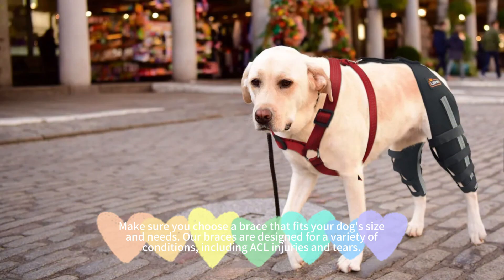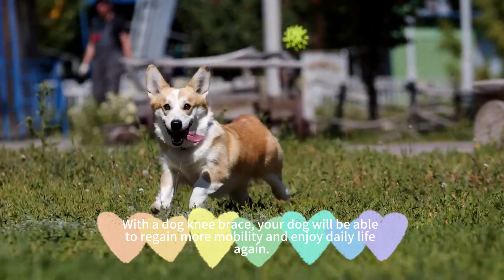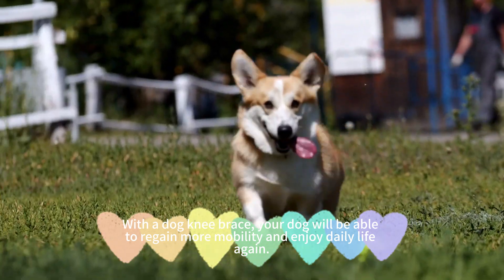Make sure you choose a brace that fits your dog's size and needs. Our braces are designed for a variety of conditions, including ACL injuries and other conditions. With a dog knee brace, your dog will be able to regain more mobility and enjoy daily life again.